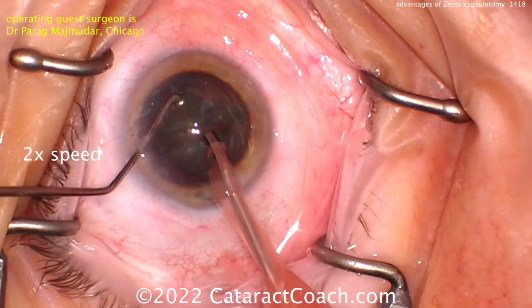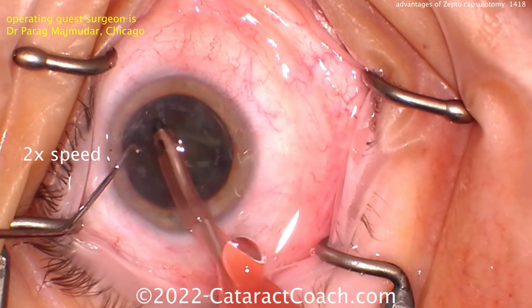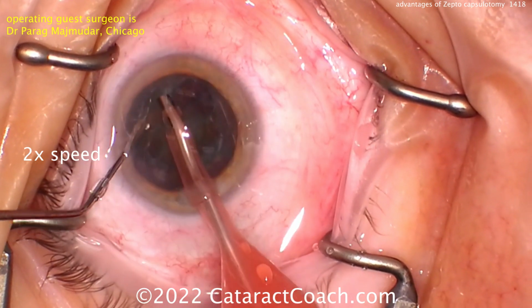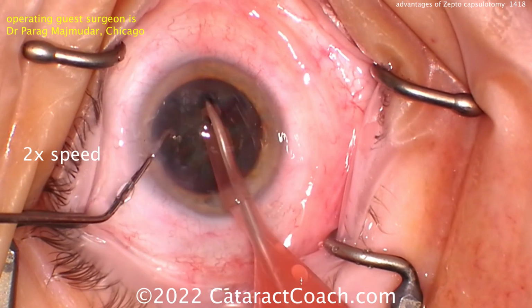And you can see here, Dr. Majmudar is going to break up that nucleus, a little bit of a groove made initially, and now just kind of a chop technique to break it up into smaller pieces and remove it from the eye.